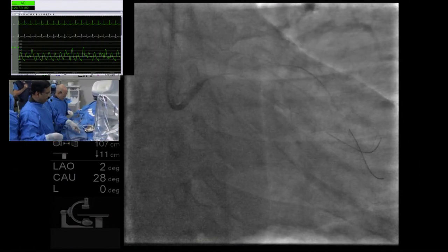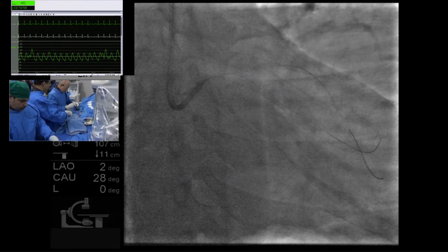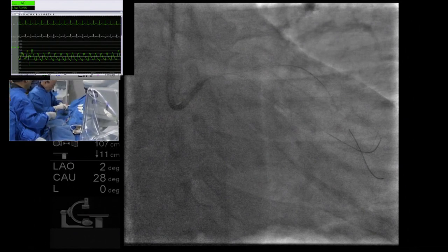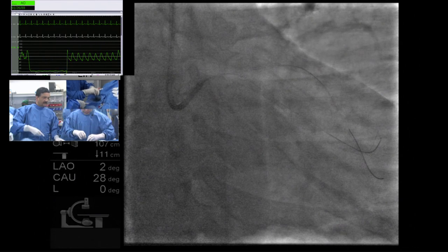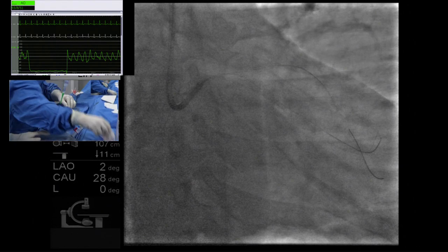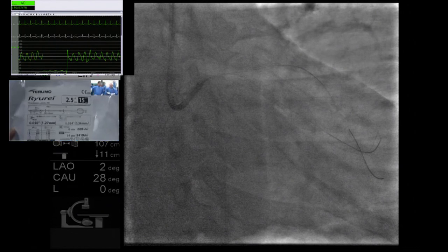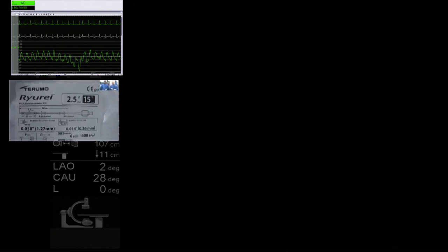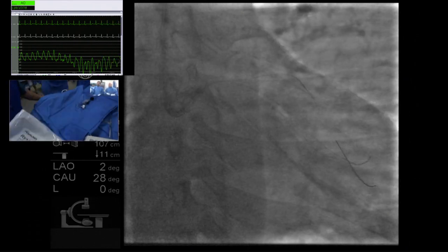It is also handy to know these techniques in complex procedures, when anchoring at the same lesion is difficult because that lesion is what you need to cross. So you need to anchor in another branch. In an LAD you could anchor yourself on a septal, which is a very safe place to anchor. And that is a technique you use in CTO sometimes for advancing the, let's say, the contralateral.